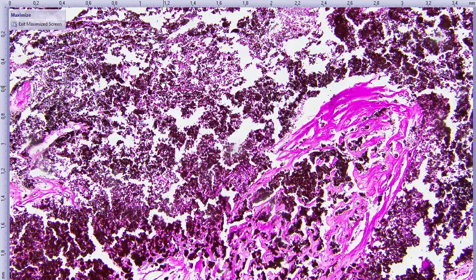We do see bone formation in iridociliary carcinomas and in some adenomas too. So there could be that, or some pre-existing mesenchymal stem cell. So we see it in the non-crazy ones, and we've seen it in crazy ones too. So it's not that abnormal to see that in iridociliary tumors.